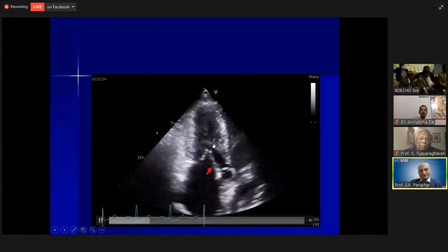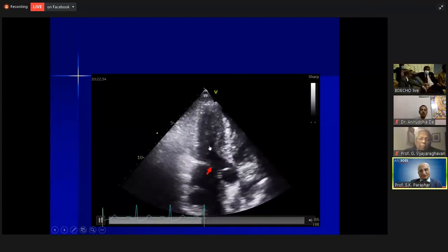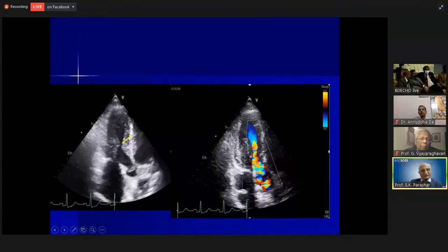You see here, so rather than putting the blame on the mitral valve, you see this. Here you see this papillary muscle, in an unusual position with thickening, produces a very narrow LVOT, and exactly at the same place there is a significant LVOT obstruction producing a gradient.